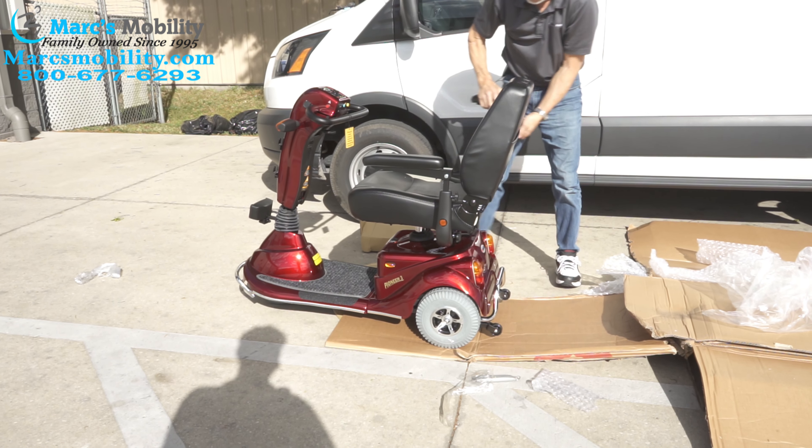This is the Pioneer 3 with the seat lift. The seat lift — there's a button on this side where the mirror is. You can see the seat lift going up right now. This has been a demonstration of how to take the Pioneer 3 scooter out of the box. Hopefully this will help you. If you watch this video two or three times, you will have no questions. This is why we do these videos. Thank you for your time.